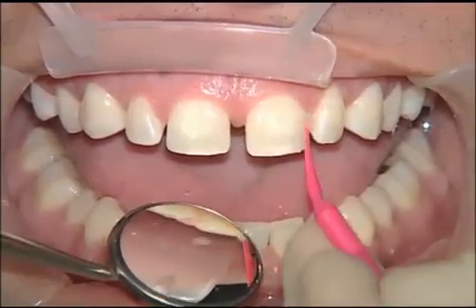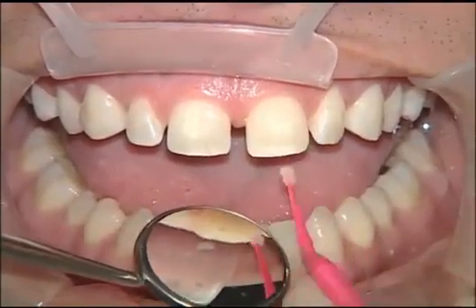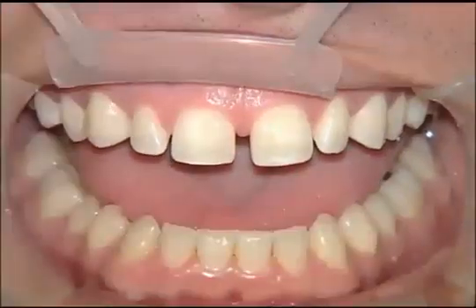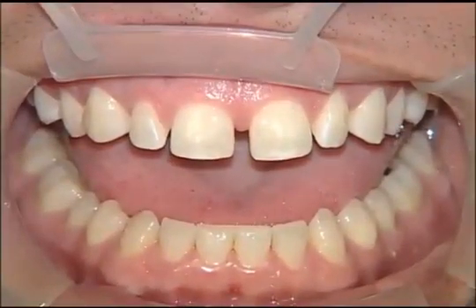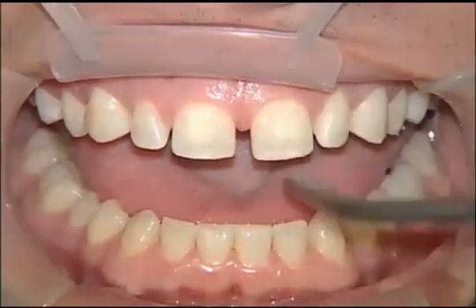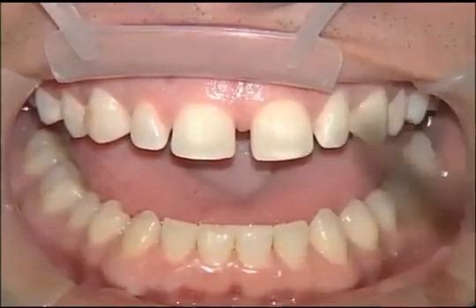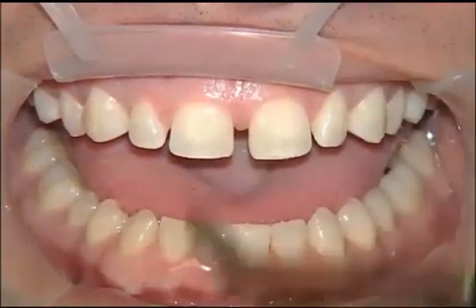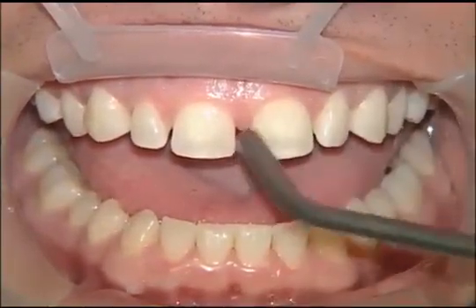As we're doing this, my assistant has cleaned the veneers, removed the water-soluble try-in paste from the veneers, and has placed the silane for 60 seconds, evaporated, and then placed a layer of the Scotch Bond inside the veneers and air thinned those as well. I'm air thinning the adhesive on the teeth right now to make sure that we don't have any pooling anywhere down by the gingival margin or anywhere else on the tooth.